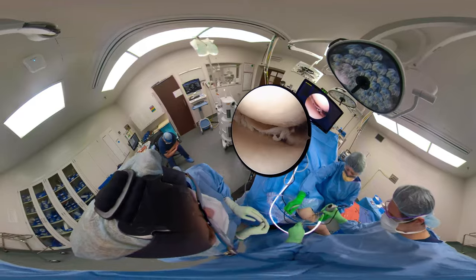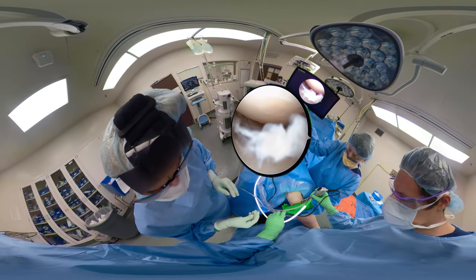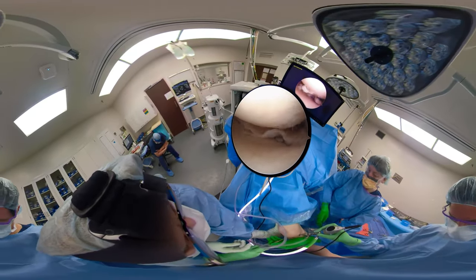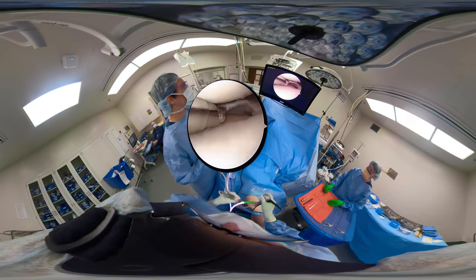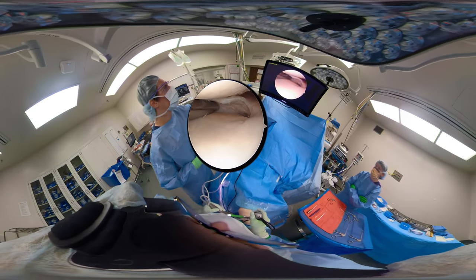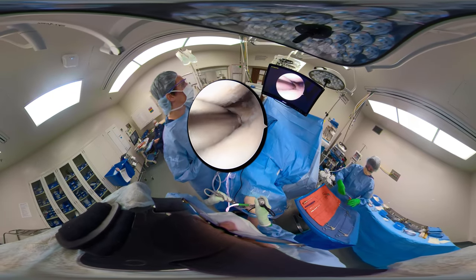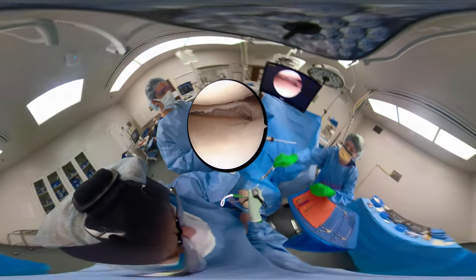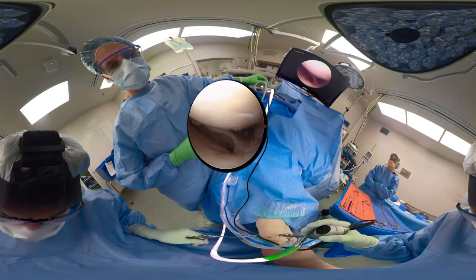Put that cannula in there, suction those fragments out — this will be more efficient and less likely to clog your curved shaver. We're pushing on the back of the knee and getting all those fragments of the meniscus out of there. Now we're completing our shaving; we've used this as a dissector to take a little more of the tibial side. The root is intact. We're going to switch our scope to the other side to better enter that mid-third medial meniscus where we need to take a little bit more.